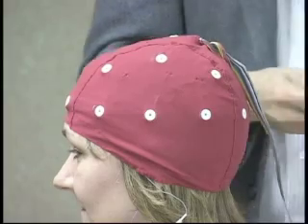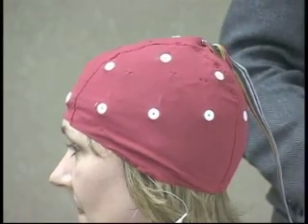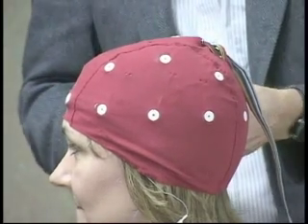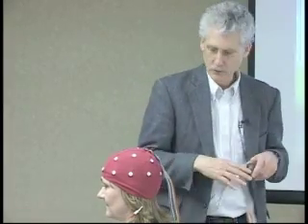Do you keep a running dialogue with the client? All the time — I'm like your barber shop guy. How's the weather today? How's it going? You have a nice trip down? How's the wife? All that stuff. Just keep them happy. Because you want good data — good data is a comfortable place. You're just doing a little mapping here like we always do. It's down home.